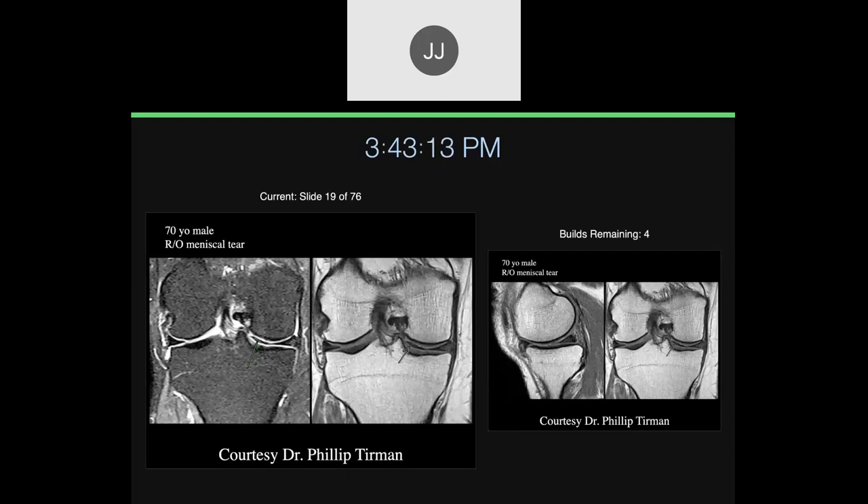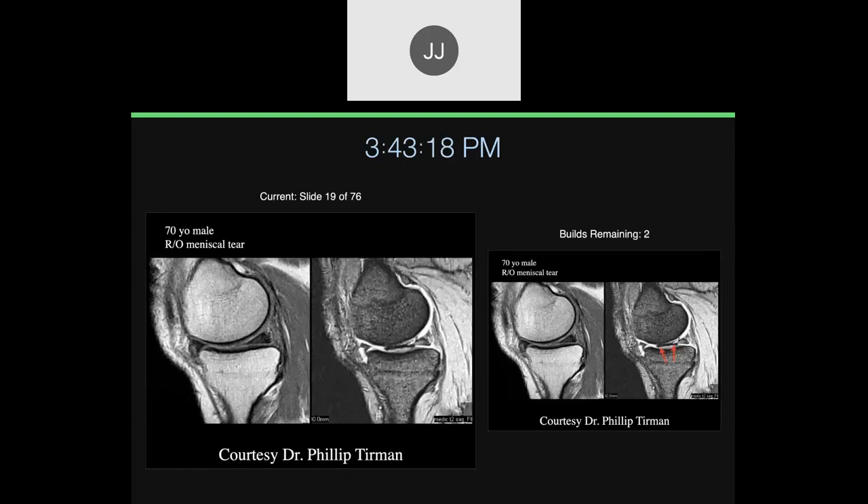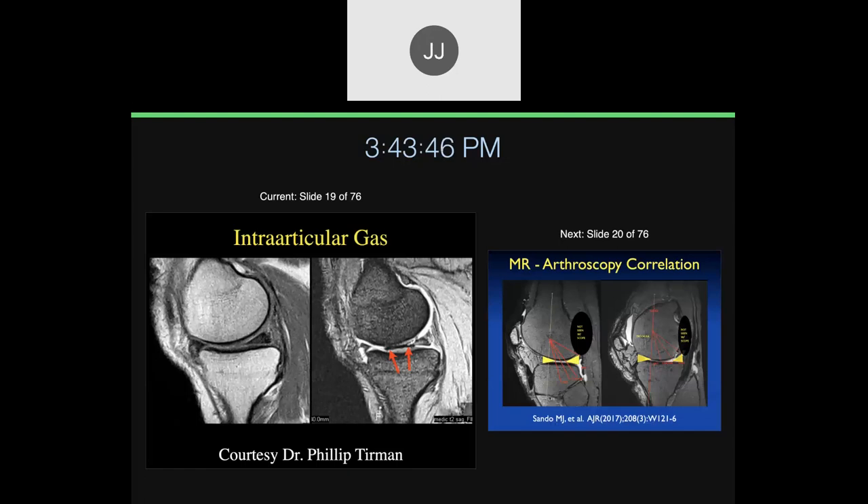You can also get a discoid medial meniscus, but they're much less common. Here's a gradient echo technique, which we don't use very often, but this is helpful because it looks different than meniscal tissue on gradient echo — it's much blacker with these little dots. This is what intraarticular gas looks like. If the patient is lying in the scanner for a while and the joint is a little distracted, you can pull nitrogen gas into the knee joint. I just want you to see these things so that when you see them clinically, you won't be confused by them. This is just intraarticular gas, and it's usually nitrogen.